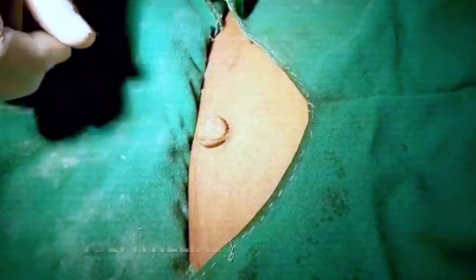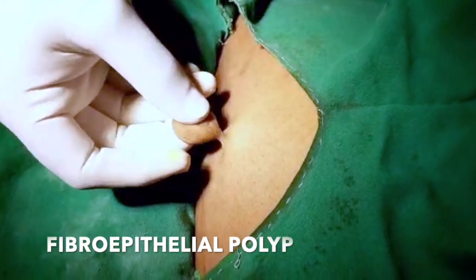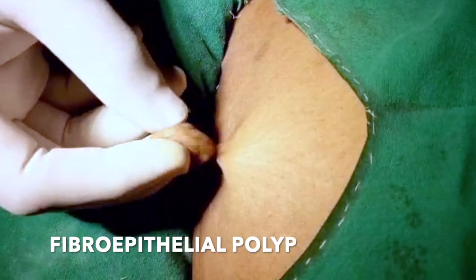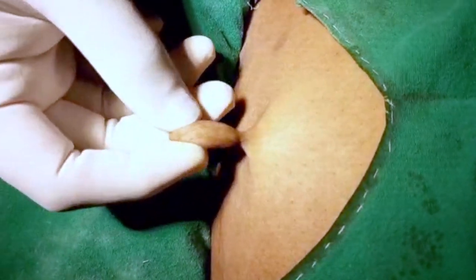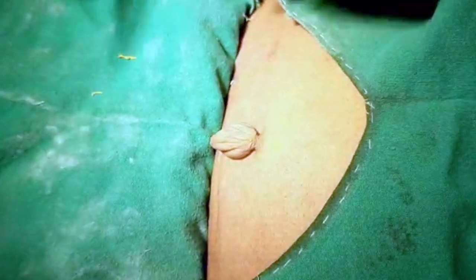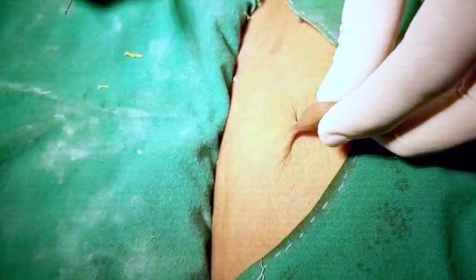This is a nodular growth. It is pedunculated, and most commonly these are clinically diagnosed as fibroepithelial polyp; sometimes it may be a lipoma. After excision we will be doing histopathological examination to confirm the diagnosis.